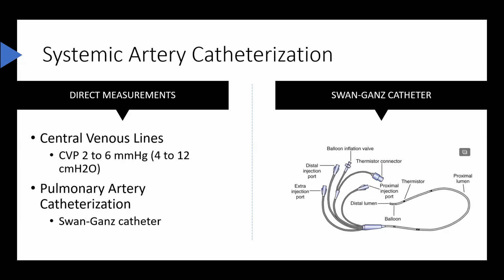Another common problem encountered with the insertion of arterial lines is hematoma formation, which can occur if bleeding occurs under the skin during or immediately after the catheterization procedure. Hematoma typically occurs more often when the catheter is placed through a large gauge needle.